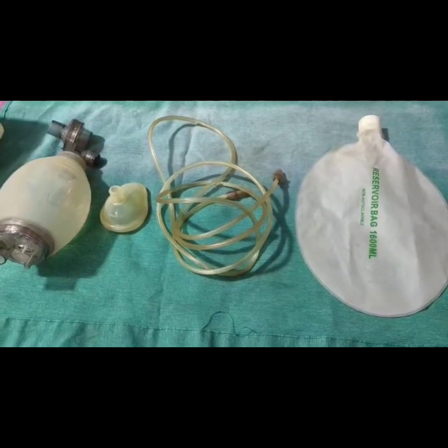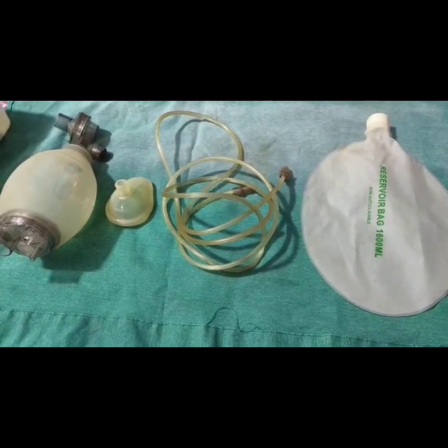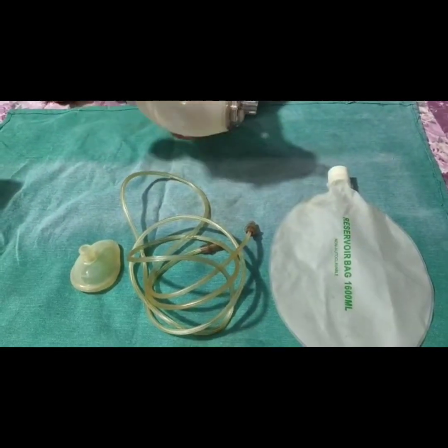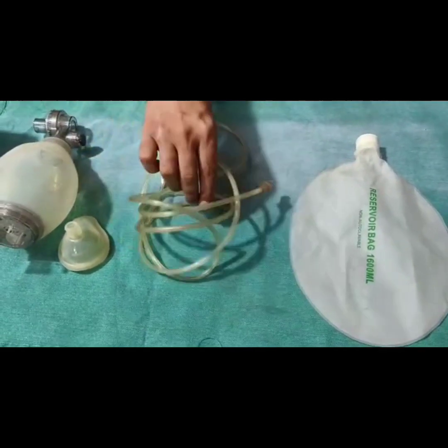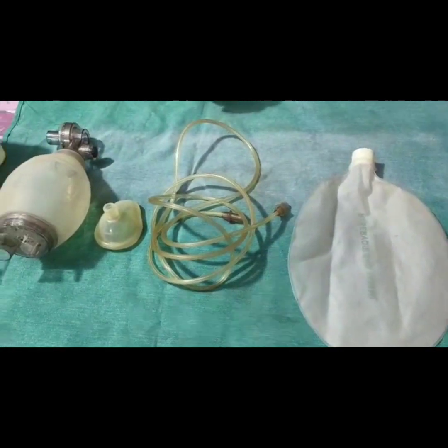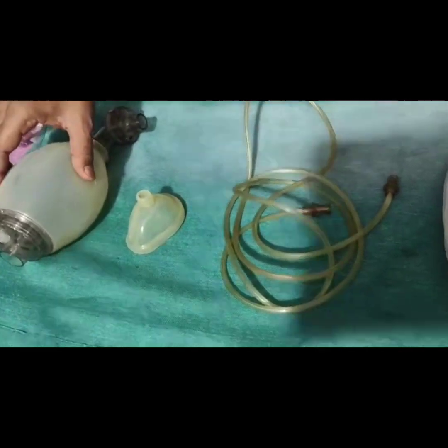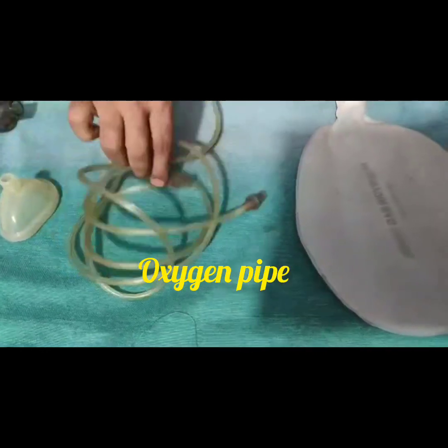In the Ambu Bag, we need to press the bag for the release of oxygen to the baby. Coming to the parts of the Ambu Bag: this is the body, this is the face mask, this is the oxygen pipe, and this is the reservoir. In neonates, we use the 250 ml size.